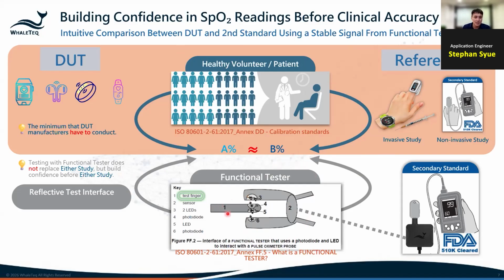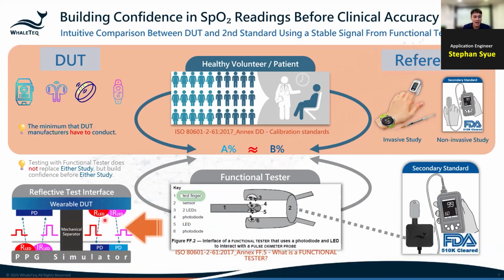And in the original context, it mentioned a test finger like this. But for the wearables, we also provide the reflected interface as here. Yeah, the illustration Kyle mentioned in the first few slides.